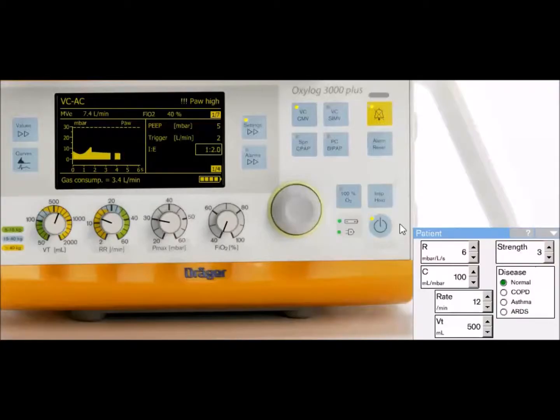I switch the strength to 3 and we're going to start having some spontaneous breaths. So we notice our breaths. There's a mandatory breath. There's a spontaneous breath there also. So the patient's allowed to spontaneously breathe, but they cannot set their own inspiratory time or their tidal volume either. So it does not allow for the coordination of mandatory and spontaneous breaths.